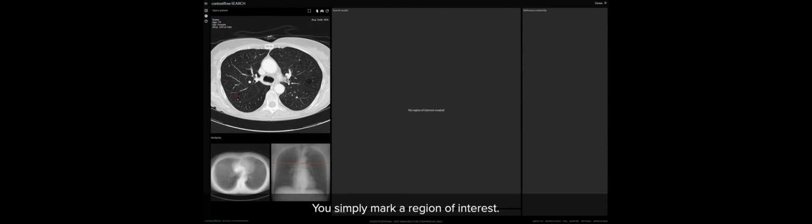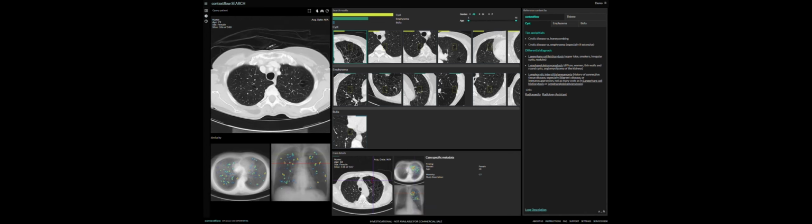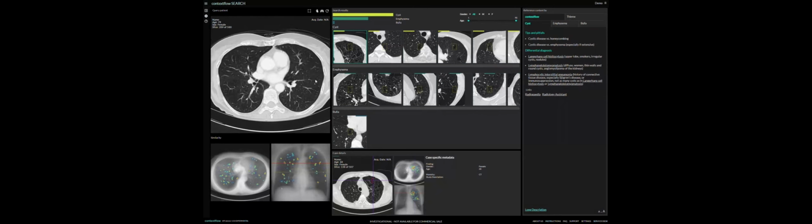So you can see over there how the radiologist is marking an anomaly, some anomalous region in the image. The system goes back, finds the most similar images from the knowledge base, and also shows at the top the 3 bars that show which patterns occur most often in this image. On the bottom left, it also shows the distribution of the pattern in the lung of interest.